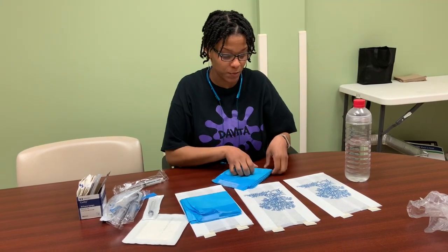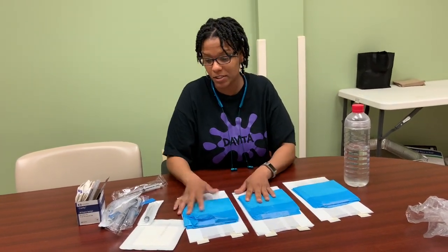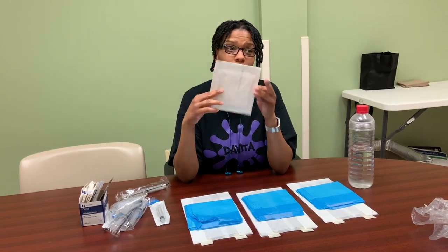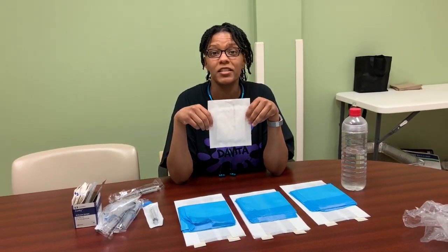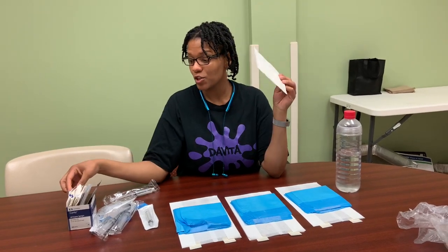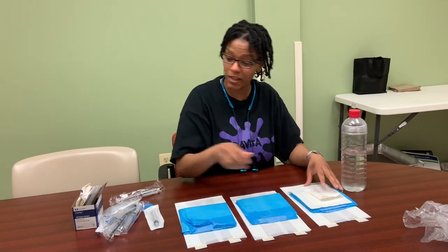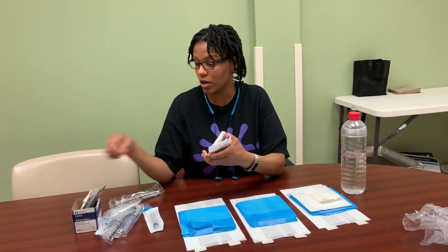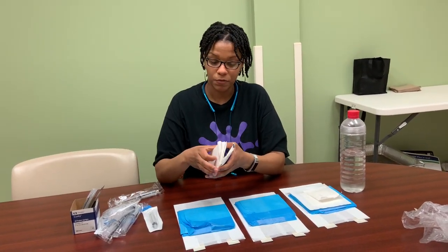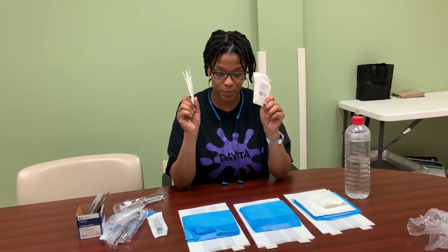Then we have gauze. The bigger gauze are used to make the CVC packs. CVCs are the ones that go through the chest, so we use a 4x4 and a 2x2 for that. With our regular fistulas — that's the needle through the arm — we use like three 2x2s. I'm really cold so I'm trying not to shiver, but I'm cold.